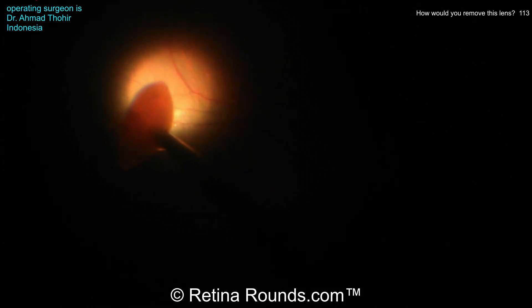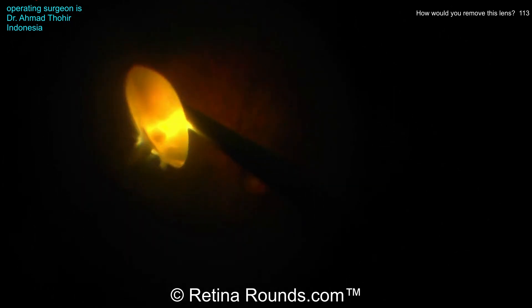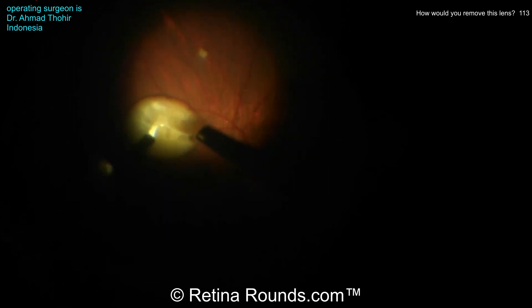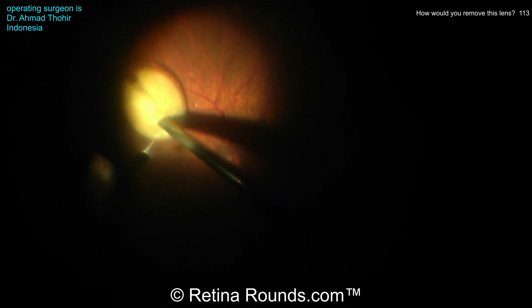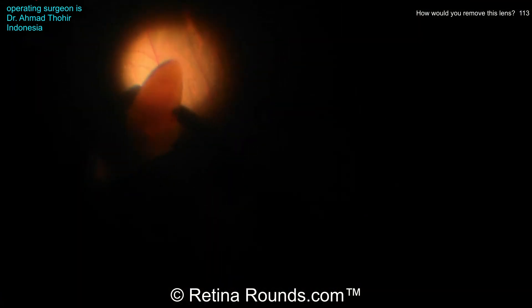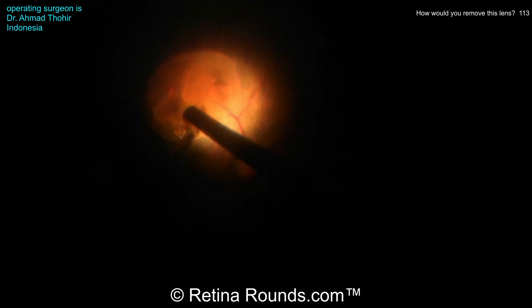The frag is being used to elevate up this lens, which is a really good idea. You want to make sure that this lens is away from the retina when you're engaging the ultrasound with the frag probe, because the ultrasound energy from the frag, if it's too close to the retina, could potentially cause iatrogenic damage to the retina. Dr. Tohir is using the light pipe almost like a second instrument to hold the lens in place so that the frag probe can engage and cut through that lens. It can also be used almost like a chopper to crack or chop this lens into smaller pieces, but this looks to be a pretty dense lens, so chopping it may not be the most efficient option.